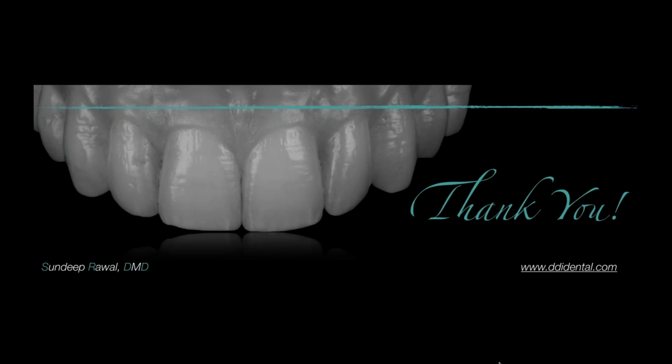We do have a couple more. The next one is, what benefits, if any, do you see in using a scanner and CBCT from the same manufacturer versus different manufacturers? Yeah, that's a great question. Look, that brings up the whole discussion of open versus closed architecture. There are going to be systems out there where the scanner and CBCT machine function on a closed architecture circuit, meaning the software is more closed. It's not a totally open architecture.